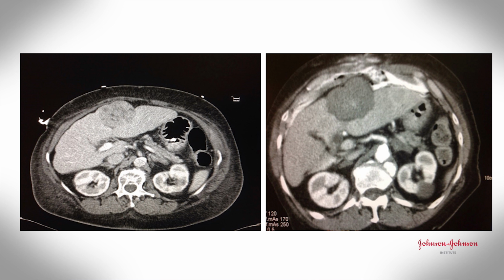Also, just set up for the organ that you're going to be working on. Now, don't overscan, and make sure your field of view is just to cover that area. Retro-recon these images to 2mm for the ablationist to be able to see it better. Remember, some studies might require IV contrast. Make sure the series that you have with IV contrast, you are able to see those lesions you target.